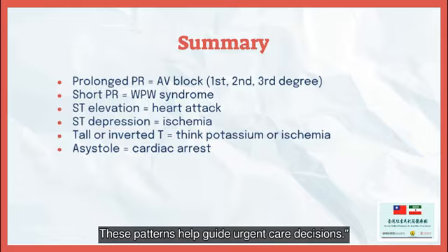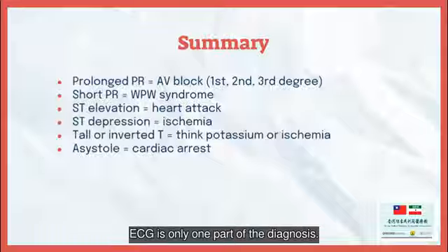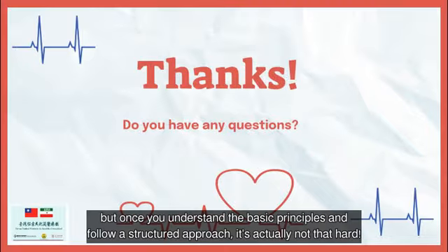These patterns help guide urgent care decisions. Always correlate ECG findings with the patient's clinical symptoms and history. ECG is only one part of the diagnosis. Interpreting an EKG may seem difficult at first, but once you understand the basic principles and follow a structured approach, it's actually not that hard.